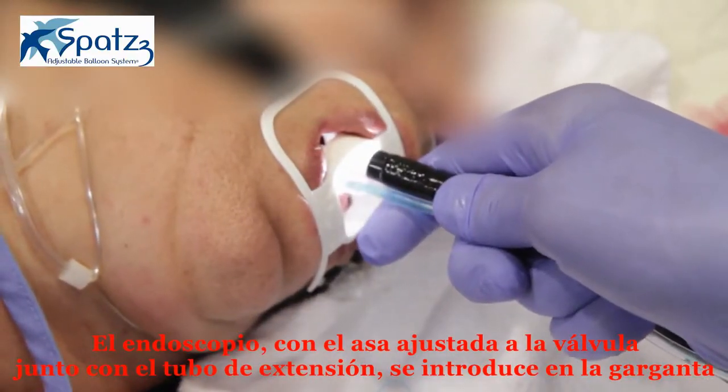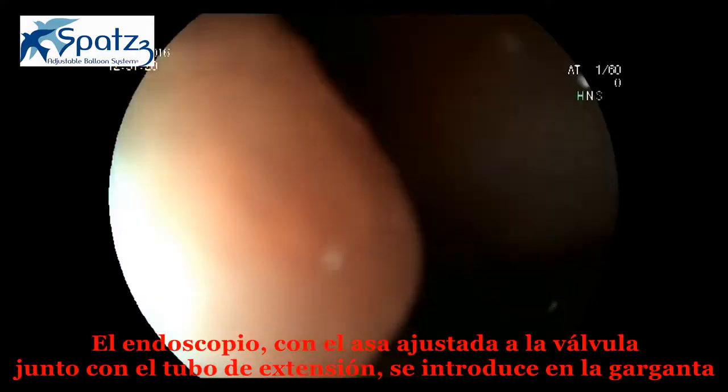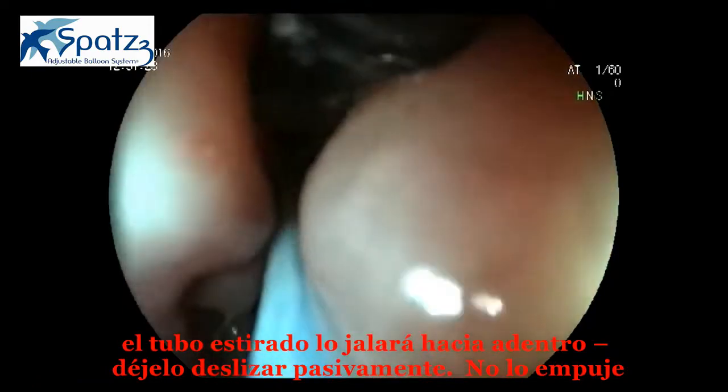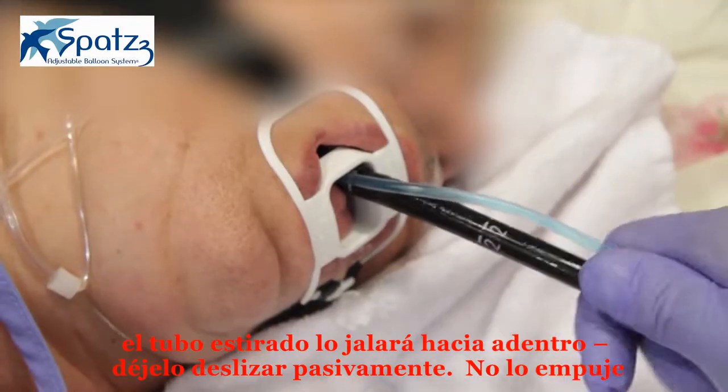The scope with its snare on the valve, together with the extension tube, are lowered into the throat. The stretched inflation tube will pull it down. Let it slide down passively. Do not push.